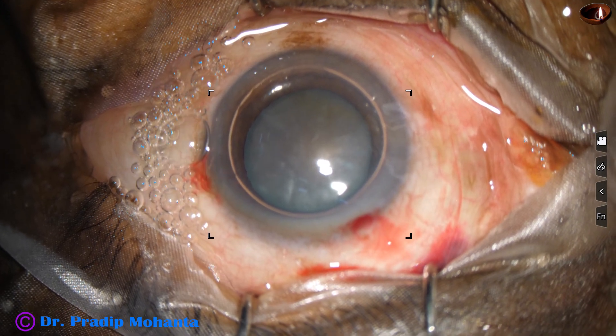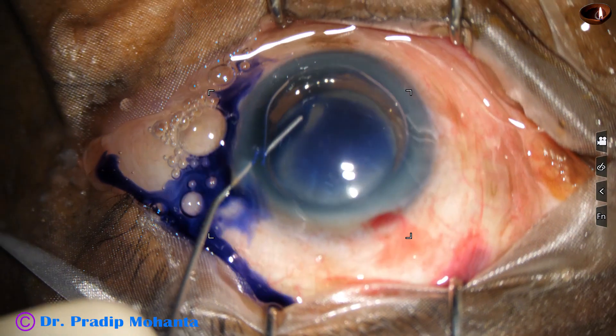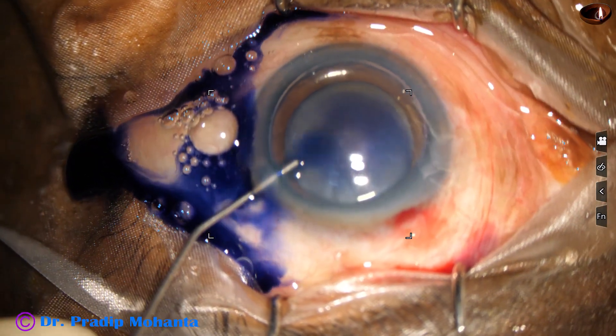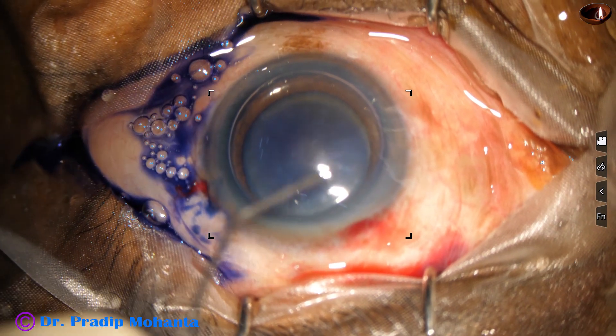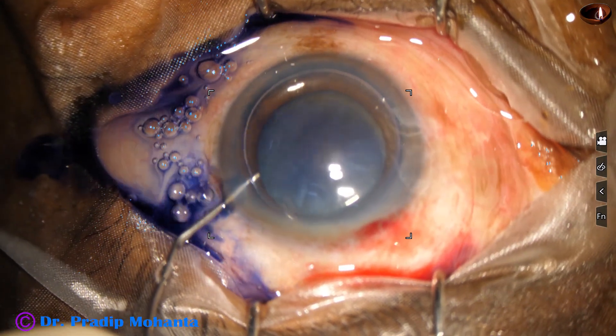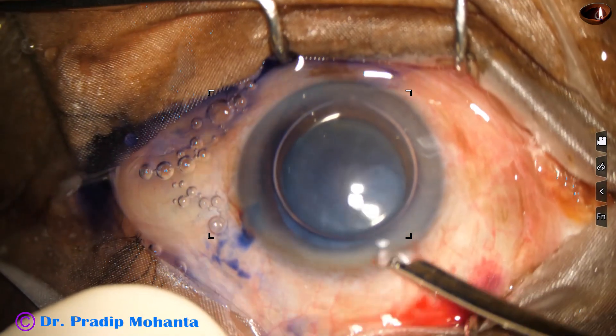An air bubble is injected. Underneath this air bubble, trypan blue dye is applied on all parts of the anterior capsule. Now this is a bit of adrenaline, and now the dye is washed out.